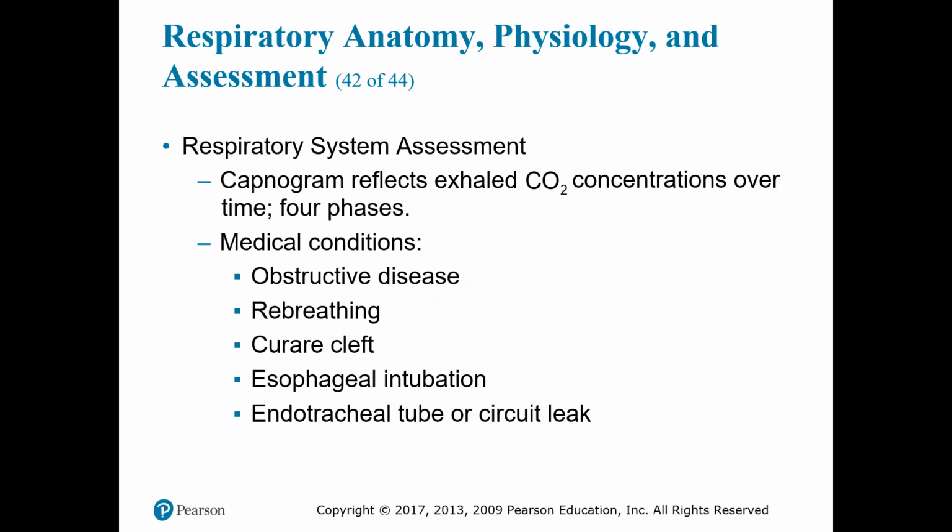Then phase 2 is the respiratory upstroke. This reflects the appearance of CO2 in the alveoli. So where you would think that the upswing would be your inhalation, it actually is not, because it's measuring the increase in CO2. So that's your exhalation, that's your expiratory phase. So in phase 2, you're going to see the upswing as the CO2 increases. It reflects the appearance of CO2 in the alveoli.